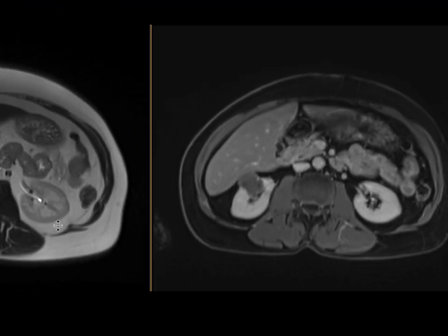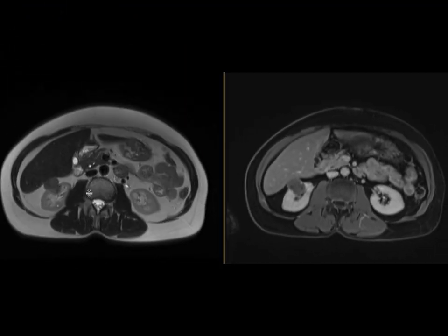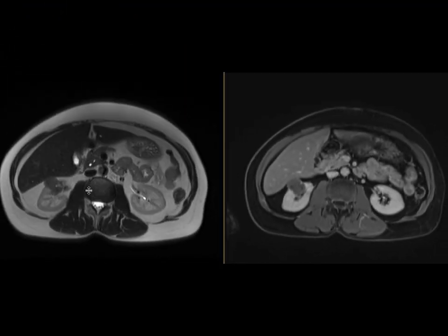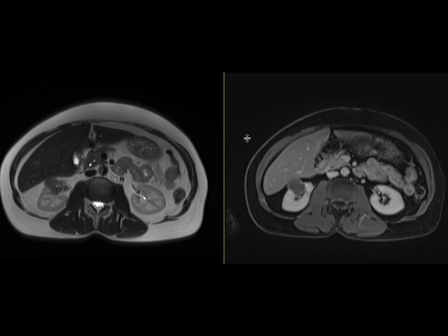This imaging feature of a T2 hypo-intense renal mass with low-level enhancement is a classic finding of papillary cell renal neoplasms. The most common renal cell neoplasm is clear cell, which tends to have more hyper-intense T2 signal and more brisk enhancement. Papillary cell neoplasms have sort of the opposite signal.